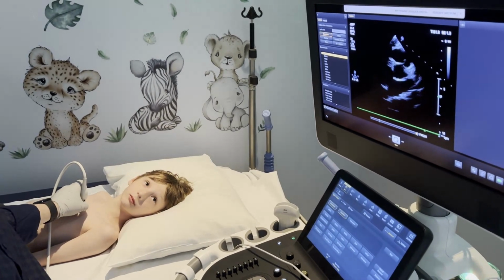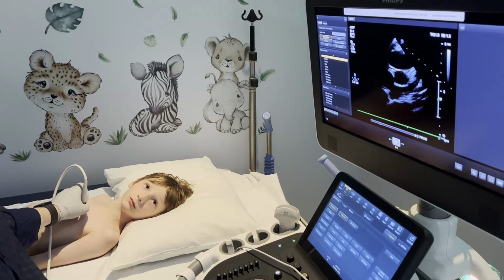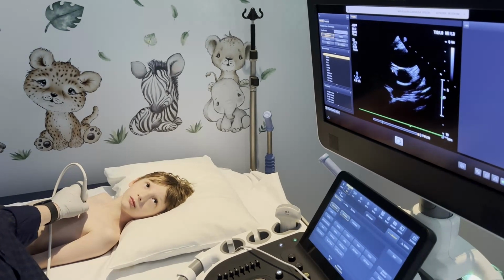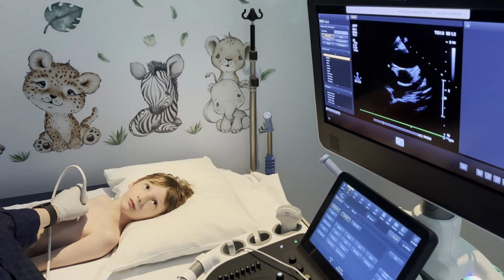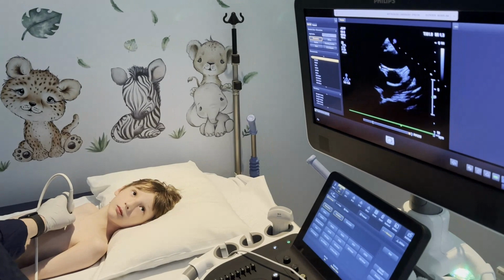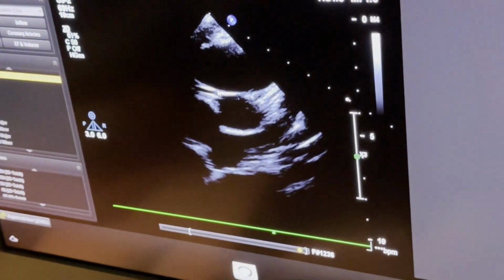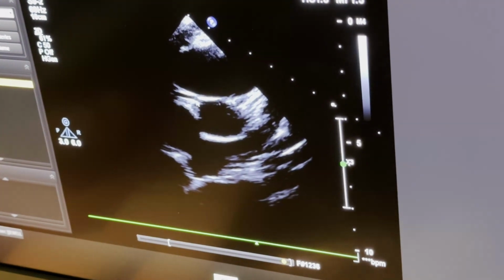The reason for that is in pediatrics, we deal a lot with Kawasaki's. So we want to be able to see as far out on this right coronary artery as what we can. So here's his right, and we can see it coursing all the way through here. This little ditzel right there is called his conal artery, first branch off the right.